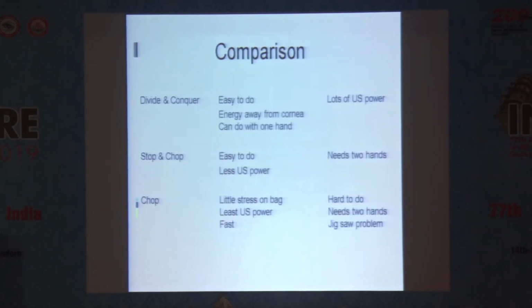So comparing all three, divide and conquer is easy to do, but requires lots of energy. Stop and chop is between the two, and I think everyone can master this. The chop technique requires a little bit more experience, but if you are a beginner, go graduating from divide and conquer to stop and chop, and then chop.